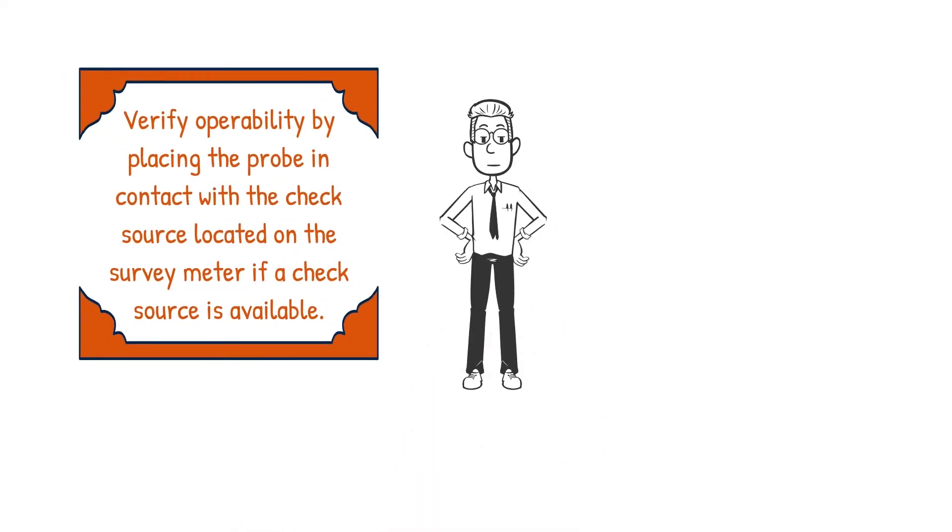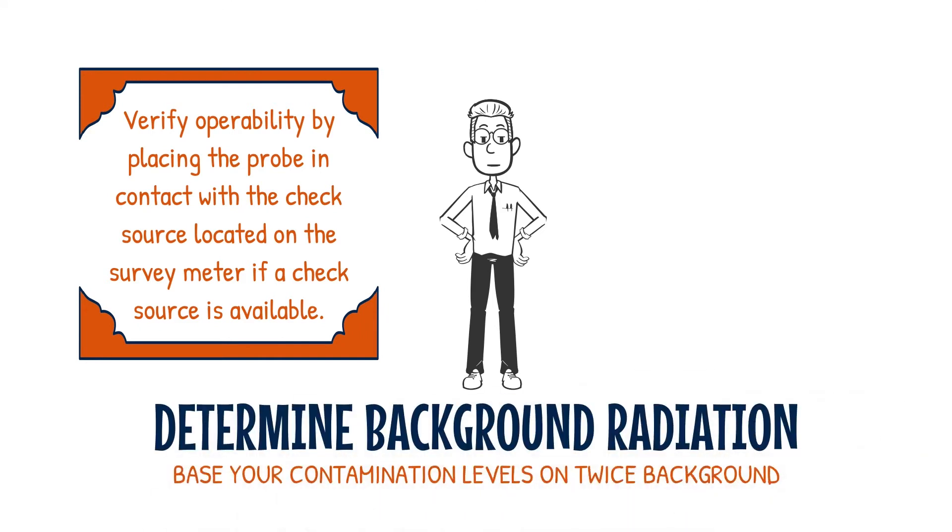Verify operability by placing the probe in contact with the check source located on the survey meter, if a check source is available.